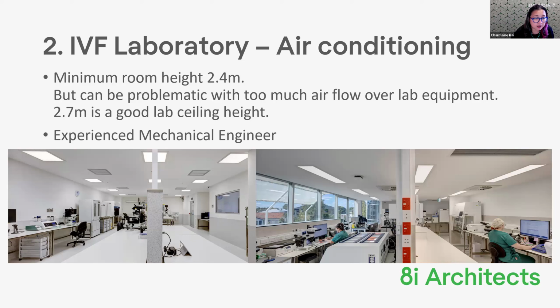Having the different types of diffusers. So on the lab on the left, the diffusers, which is where the air comes out of the vents, are a stainless steel plate with perforated holes in it. Tiny little holes that are probably only about 5 millimeters, even sometimes less in diameter. So it's a perforated mesh. Ideally in a lab, that's the type of register you want, because it pushes air through, but it doesn't push it through in such a strong direction. It actually dissipates within the lab.